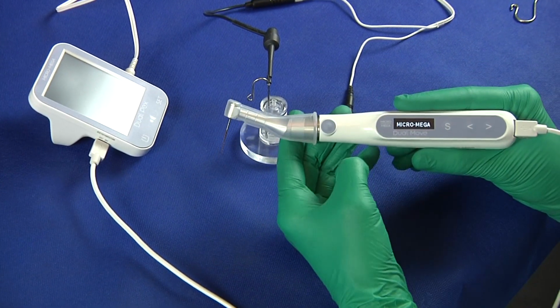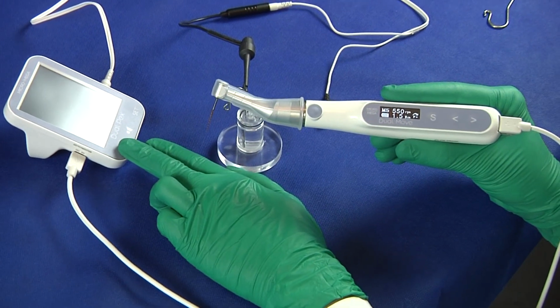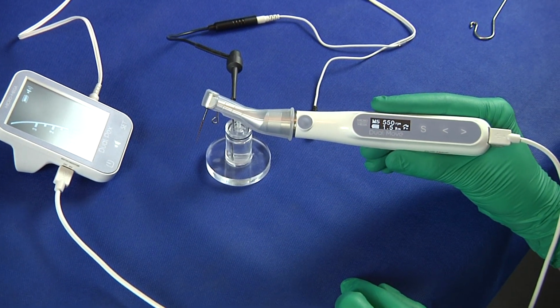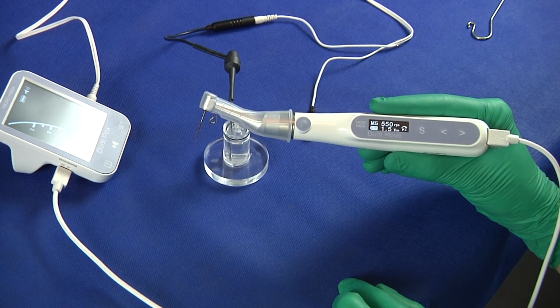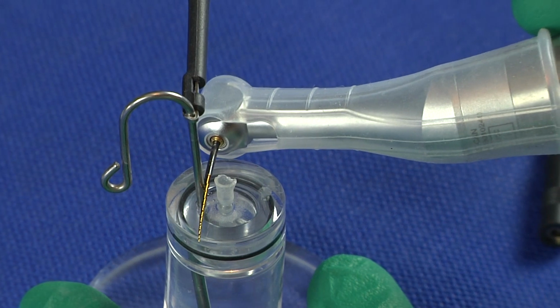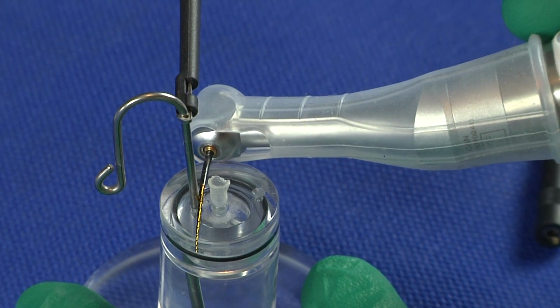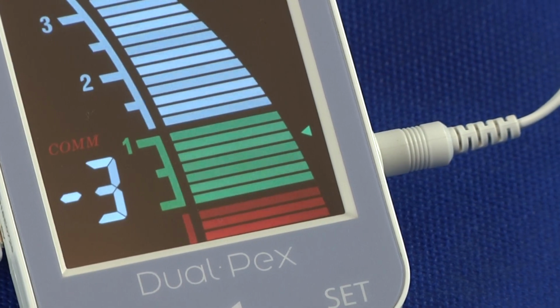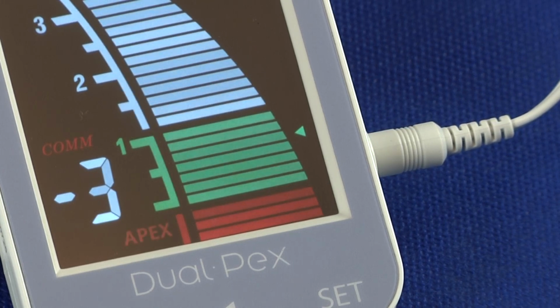Switch on Dual Move. Power on Dual PEX. Connected is briefly displayed on Dual Move's screen. Hang the lip hook on the patient's lower lip. Before starting the treatment, create a short circuit between the lip hook and the file. All the bars shall appear on Dual Move's display. You can start the root canal preparation.